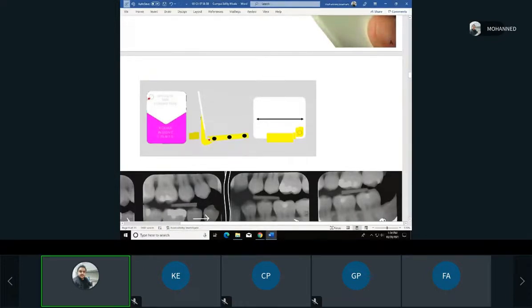So this gives us a systemic approach. You're always placing it in the slot, which would usually be the occlusal surface of the teeth, right? So the dot is always lined up. If these are the teeth, for example, we have a molar here. It's with the occlusal surface of the teeth usually. Even if it's a mandible, same thing. It will always be with the occlusal, because if you place the dot here and then we have a periapical abscess or problem, then it can cover it.